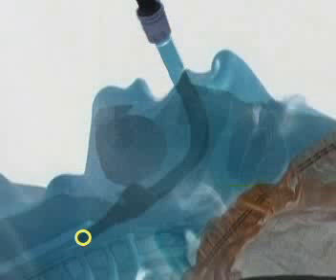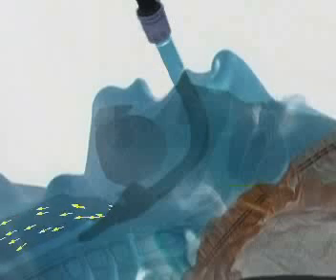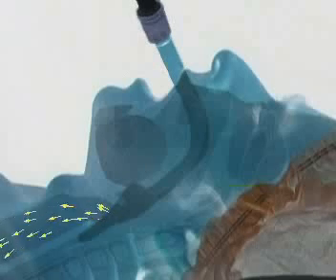The tip of the cuff is now sitting over the esophagus, which is acting as a form of partial stopper, either against reflux coming up or possible minor leakage of gases into the stomach. The epiglottis is resting over the top of the cuff, and the whole of that section is now completely filling the pharynx, which is a special feature of the laryngeal mask airway, because now the nitrous oxide or other gases are being directed solely through the trachea and into the lungs.